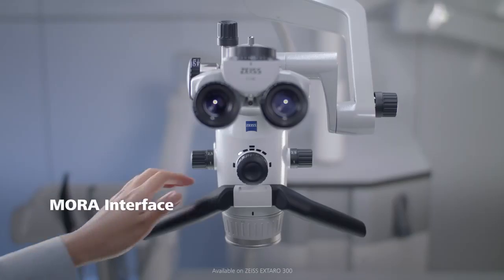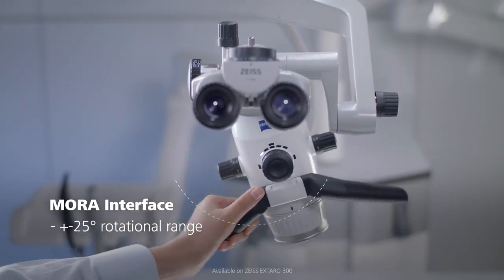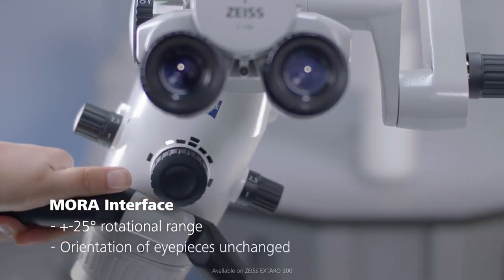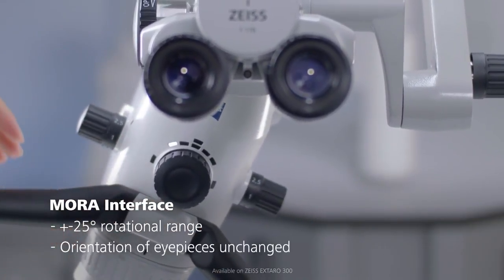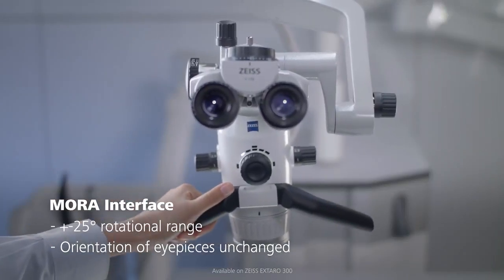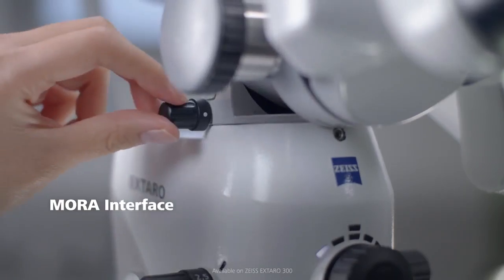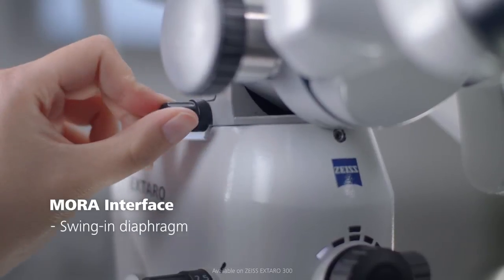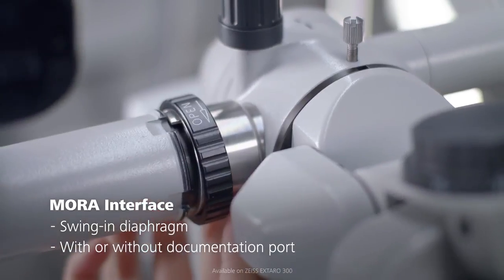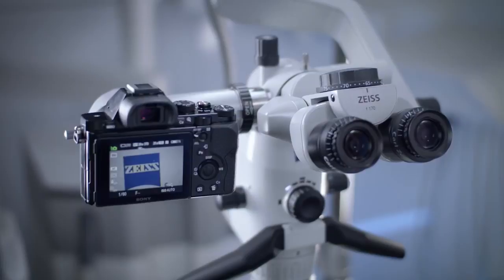The Mora interface offers a rotatable coupling system for the microscope body with plus or minus 25 degrees rotational range, which enables you to change the angle of observation without changing the orientation of the eyepieces and therefore without requiring you to change your upright ergonomic sitting posture. It also offers an integrated swing-in diaphragm to increase the depth of field. It is available with or without documentation port, and an external camera can be attached to the documentation port.